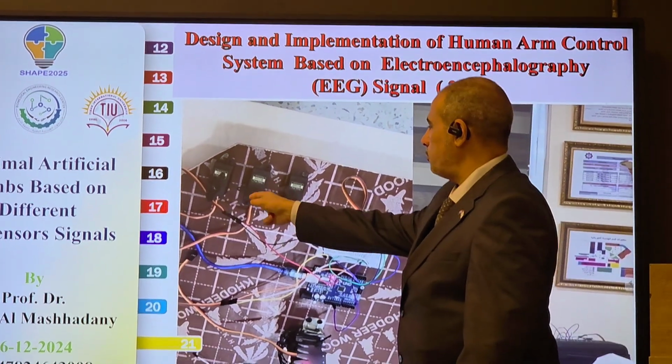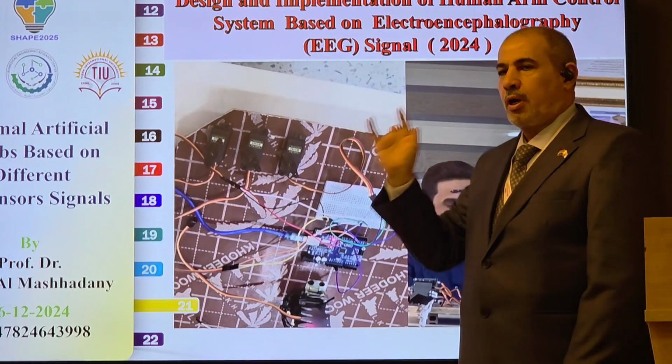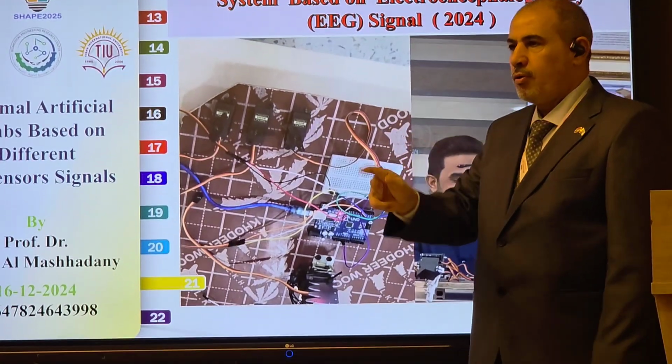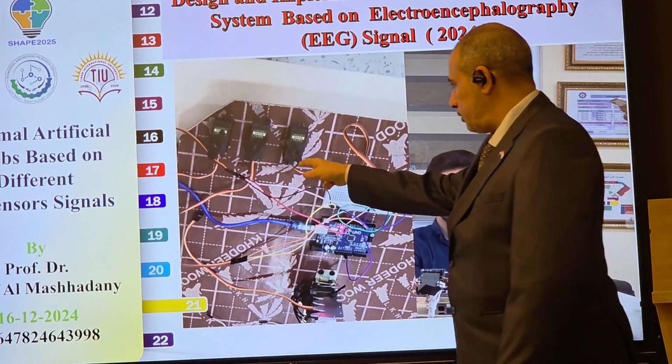For servomotor, 3 servomotors, we use servomotor as DC motor on off or pulse width modulation to apply rotation.